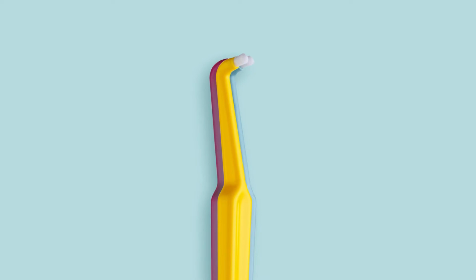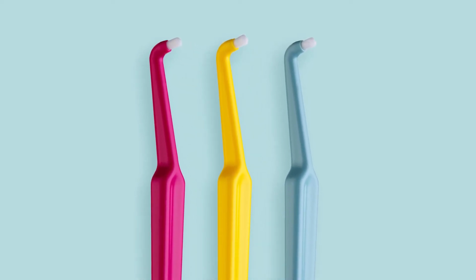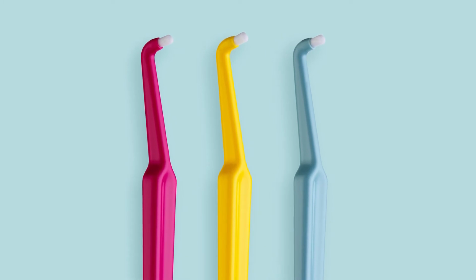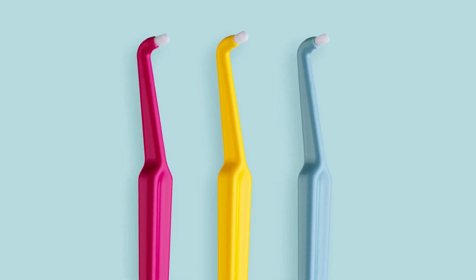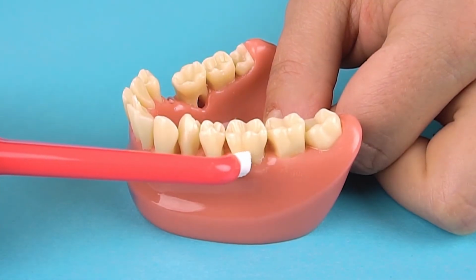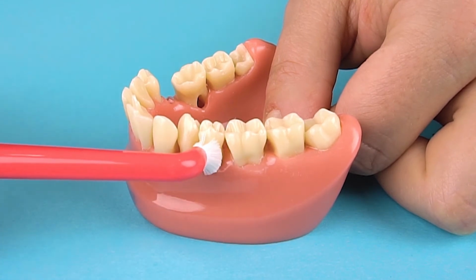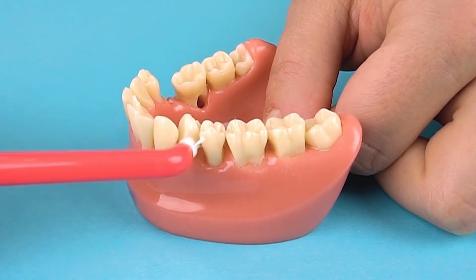Due to its versatility, instructions for using the Compact Tuft specialty brush will be unique to your situation. I will give some tips for common situations. When using along the gum line, hold the brush tip at a 45-degree angle towards the gum line, moving the tip gently back and forth.